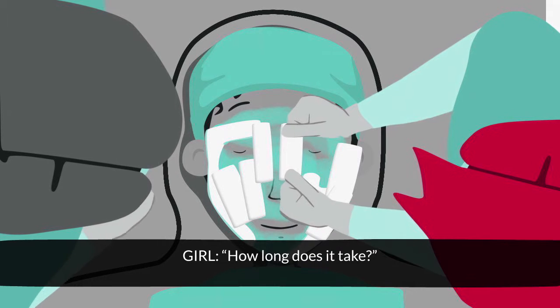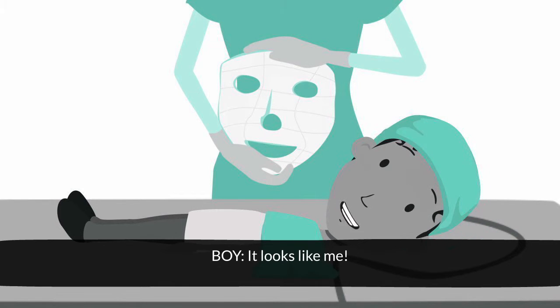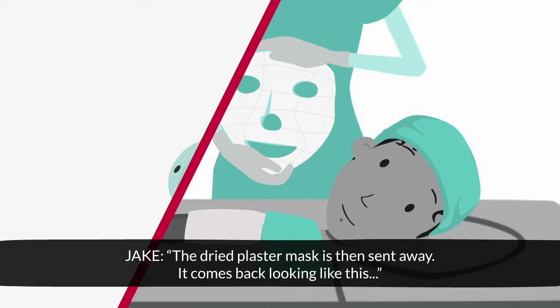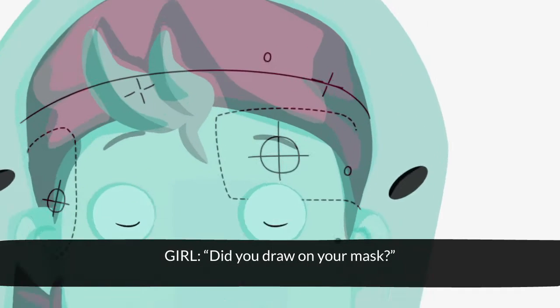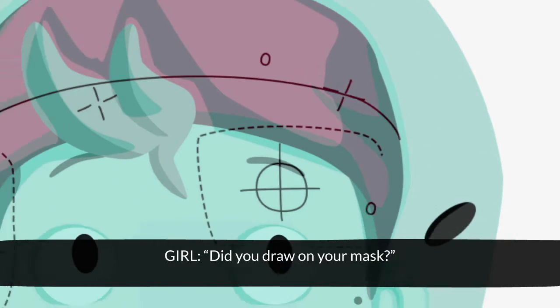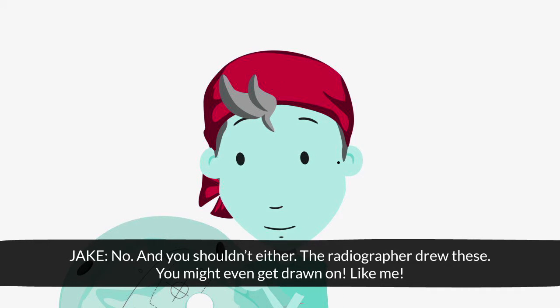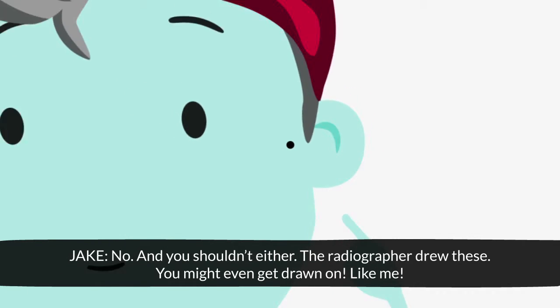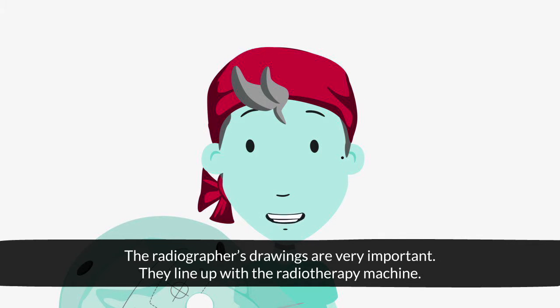How long does it take? About 30 minutes. It looks like me. The dry plaster mask is then sent away. It comes back looking like this — a perfect fit. Did you draw on your mask? No, and you shouldn't either. The radiographer drew these. You might even get drawn on, like me. The radiographer's drawings are very important — they line up with the radiotherapy machine.